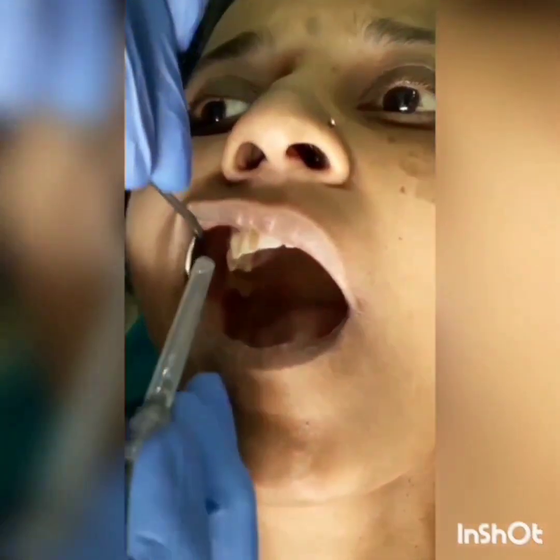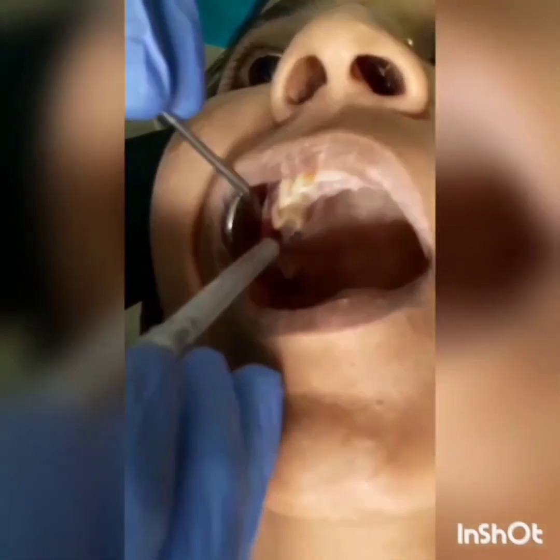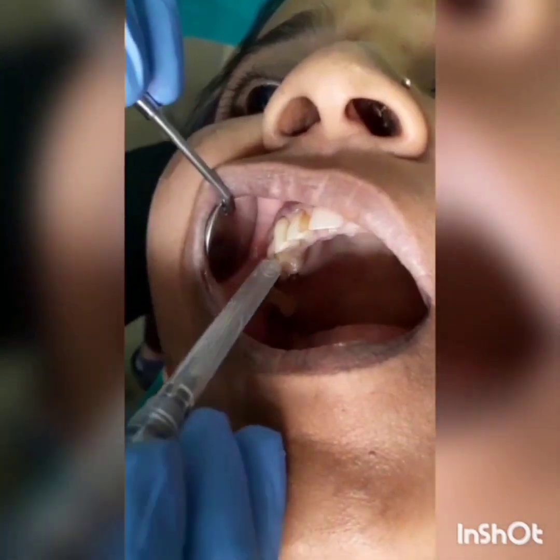Once the block is given, the three soft tissue branches get anesthetized: the lateral nasal, inferior palpebral, and superior labial. The patient complains of numbness in the area of this nerve supply. The anterior superior and middle superior alveolar nerves supply the mucoperiosteum from the central incisor till the premolar area, and also the pulp chamber of the teeth.